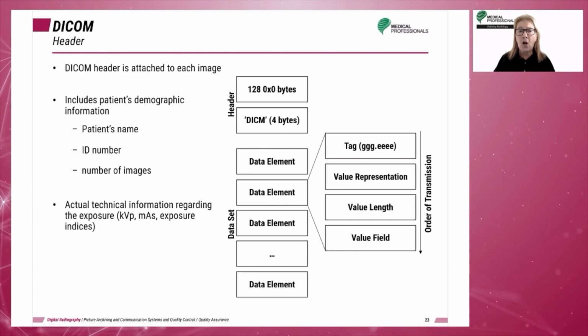According to Carter and Veal, any image manipulation is also recorded in the header, and radiographers should be aware that he or she is legally responsible for any image manipulation that occurs.